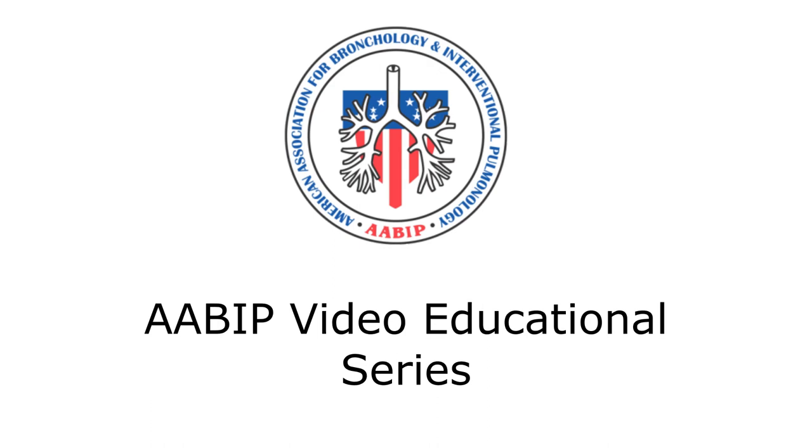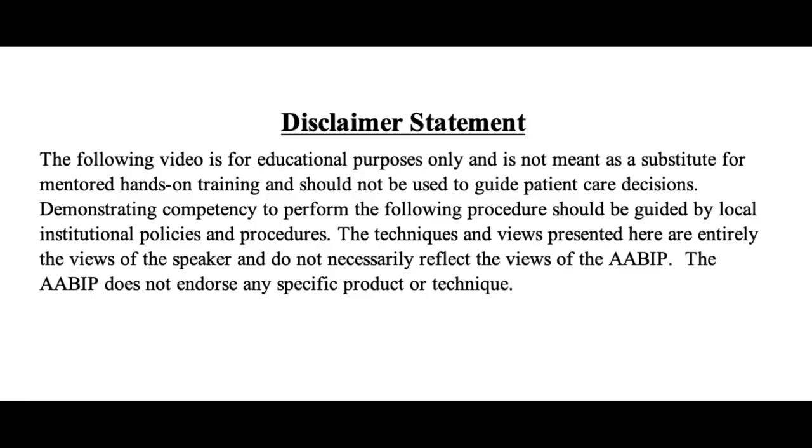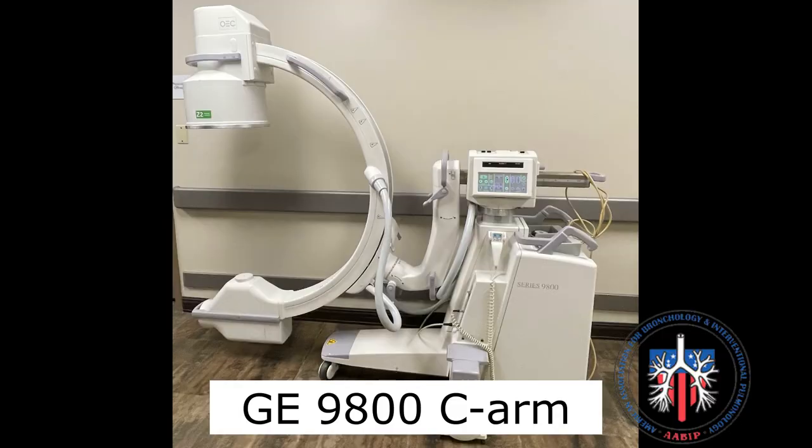AABIP Video Educational Series: Fluoroscopy Basics Part 2 — Operation of C-Arm Components. In this example, a GE9800 C-Arm will be used.